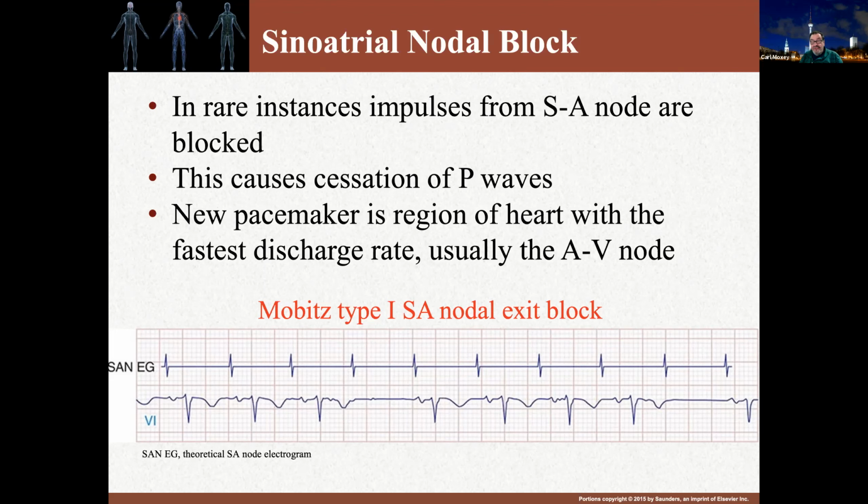The way you tell that there is a sinoatrial block in an EKG tracing is you will find dropped beats. The dropped beats will occur after a cycle, and after a dropped beat, the cycle tends to resume once more. Furthermore, the block occurs in multiples of PP intervals.